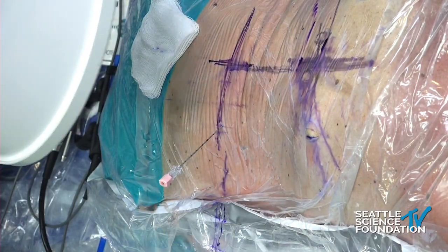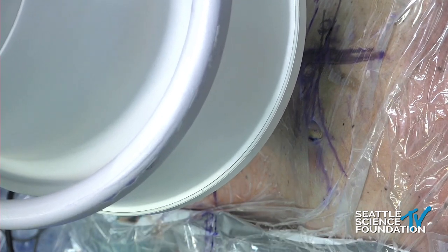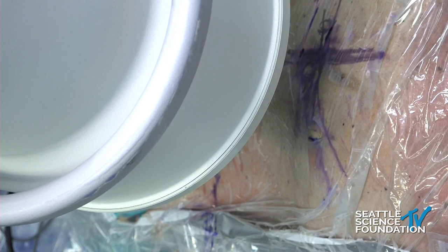Ray, when you marked that lateral view, what did you mark on the skin there? You just marked a line. The trajectory, okay. Exactly where that is to the front of the disc. So by having that line on the side of the body, I know the depth of my disc space, so I shouldn't be working past that, right? The last place you want to be is anterior to the ALL.